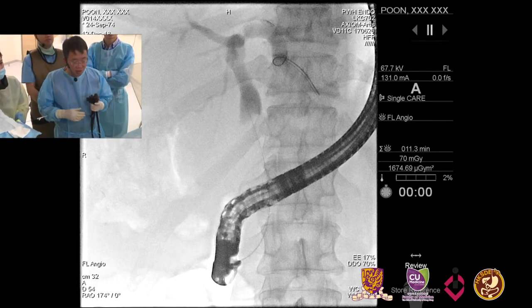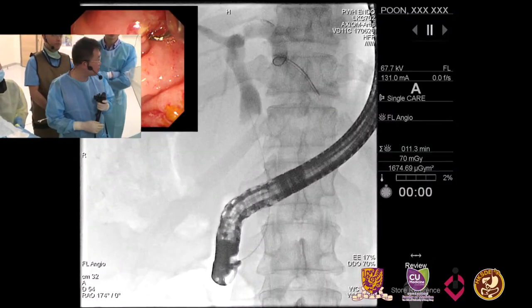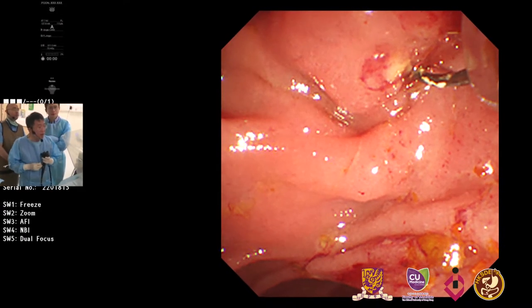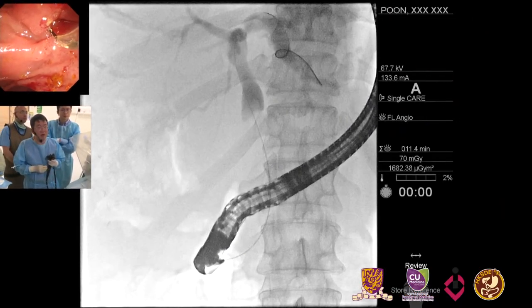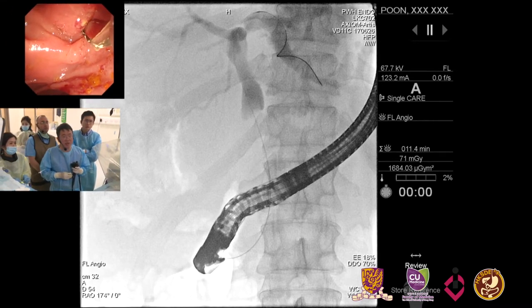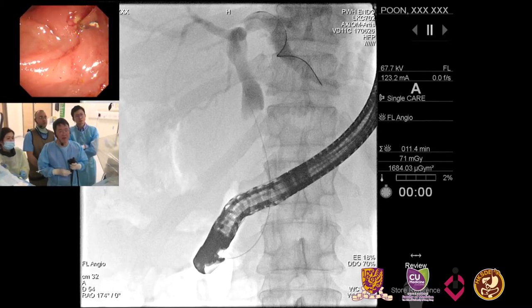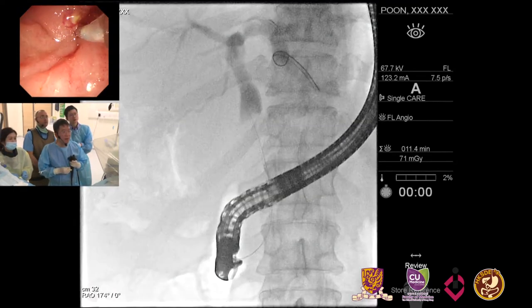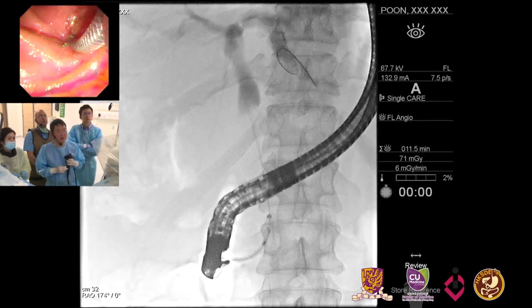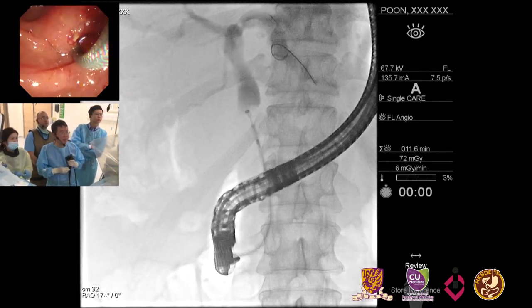And now we will show the cholangiogram we have shown on the previous film. We can show them just the active fluoro, because the dye is still there. And today I will use the Bona stent. It's from Korea. It's a hook and cross design, very similar to the Taiwan stent, and the delivery system is seven French. Now I insert the metallic stent because it's very flexible, very easy to put through the stenosis.